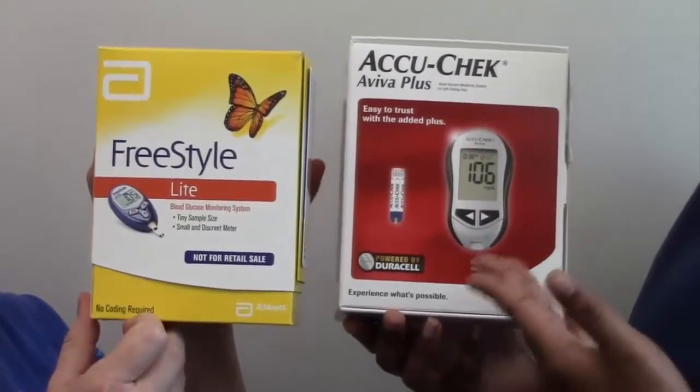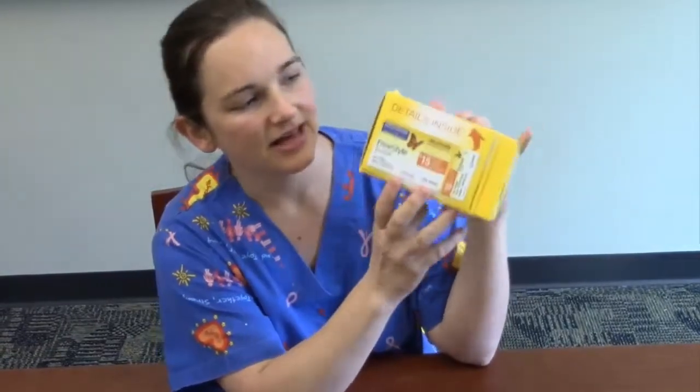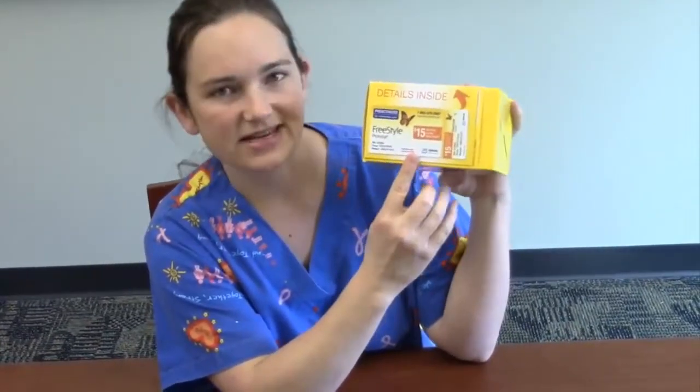We have two glucometers for our patients: the Accu-Chek Aviva Plus and the FreeStyle Lite. The FreeStyle Lite is for our patients that have private insurance. On the side of the box for the FreeStyle Lite, there's a card that can help save our family's money on test strips.